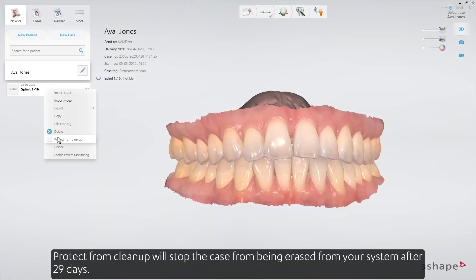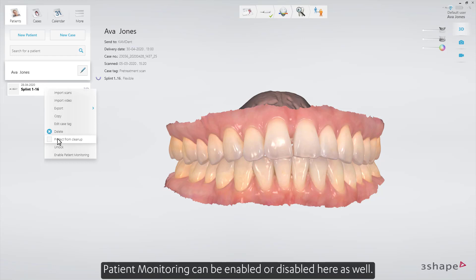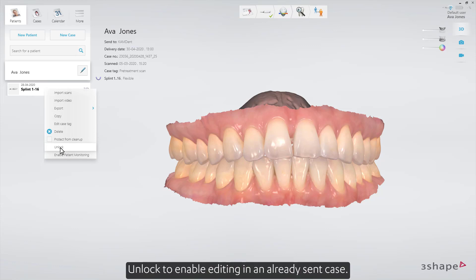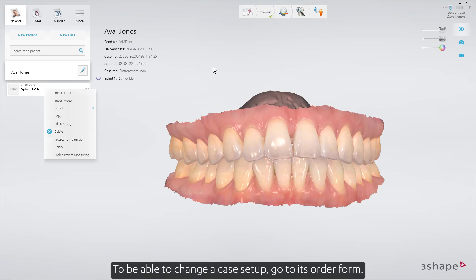Protect from cleanup will stop the case from being erased from your system after 29 days. You can use that option if the case will be used along with patient monitoring. Patient monitoring can be enabled or disabled here as well. Unlock to enable editing in an already sent case. Deleting of a case is also possible here. To be able to change a case setup, go to its order form.